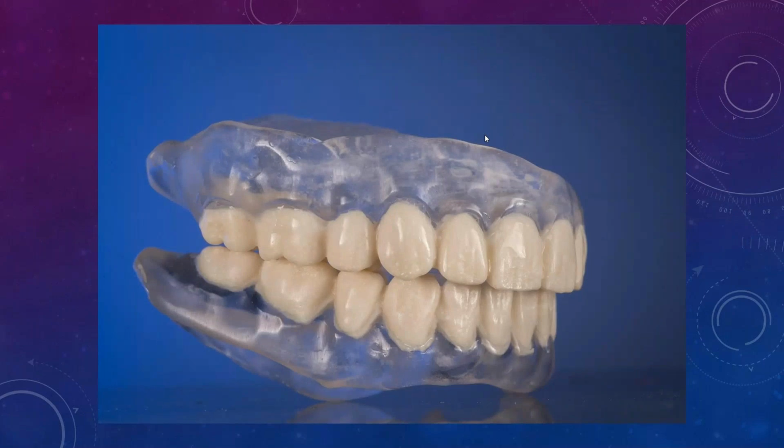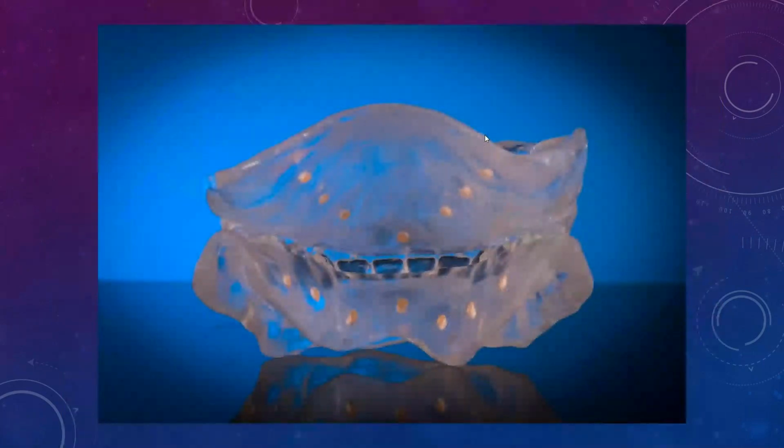So the way the dual scan protocol works is that you basically scan the patient with the denture in the mouth. And then for the second scan, you change the settings of the CT scanner to pediatric scan, and you place the denture on the foam block that sits on top of that little room where you do the scan, and scan that. And you can overlap those two scans together and get a much better presentation of what the denture looks like in the patient's mouth.